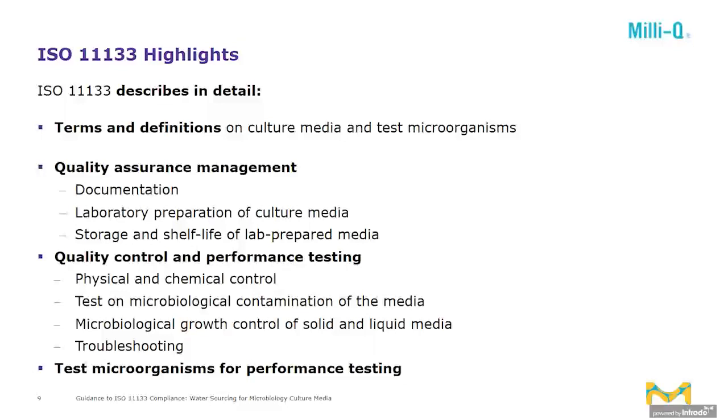And it includes also a detailed description for the preparation and handling of the test microorganisms for the performance testing of the culture media. Besides this main topic, it has a lot of other topics included in the standard. The standard itself has more than 120 pages and all topics around the quality assurance of culture media.